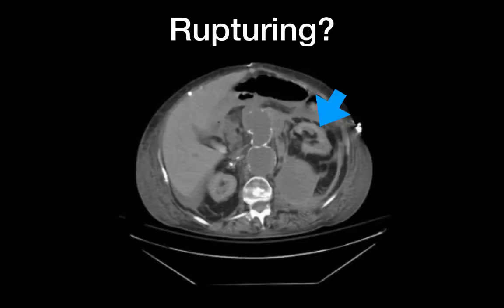I have a few images of some ruptured AAAs here. This is a big ruptured AAA. It has ruptured into this left posterior perirenal space and has displaced this left kidney anteriorly. I noticed this in doing FAST exams on ruptured AAAs and trying to find my normal anatomic landmarks and not having great success looking at kidneys. There's no data to back this up.